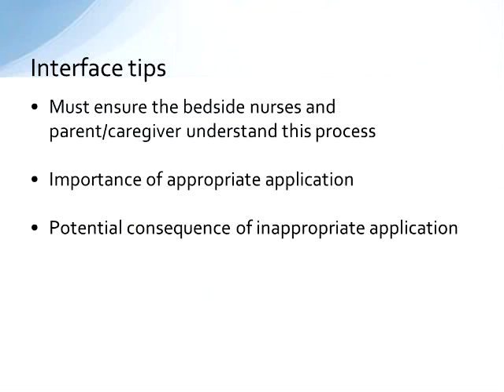And I think that you need to also be really clear with them about the potential consequences associated with inappropriate mask placement. Of course, no one comes to work with the hope of maliciously injuring a child, and so when we end up with masks that are too tight, that's an education piece that's missing, not a malicious intent. Certainly, I think we would all agree with that. So we need to be educating all caregivers, all members of the medical team, about the potential consequence of inappropriate application for these kiddos.